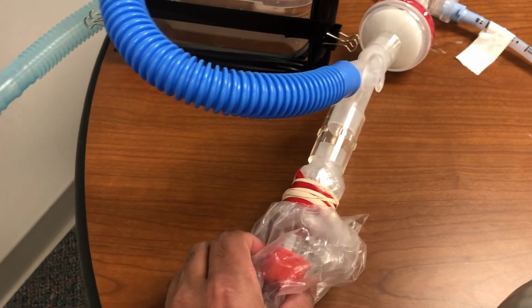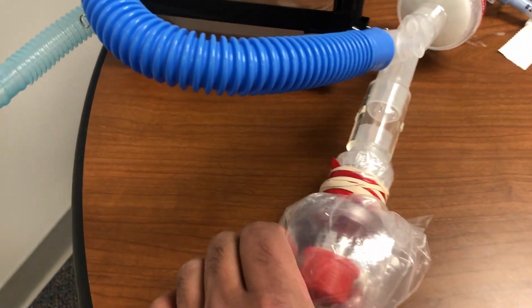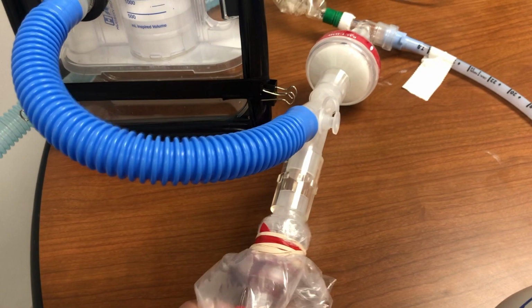I'll try to do it with one hand, but try to change the PEEP again to a higher level. I think I need both my hands, but I'll try.